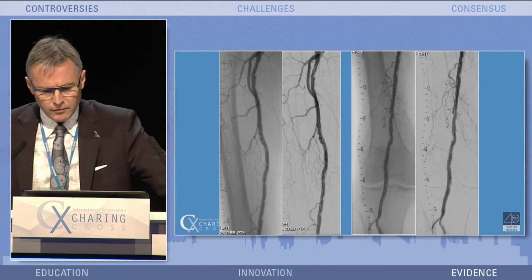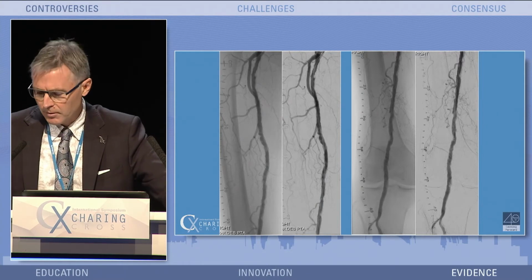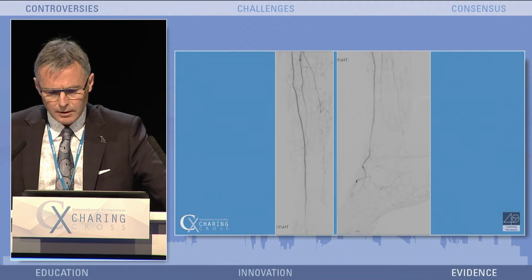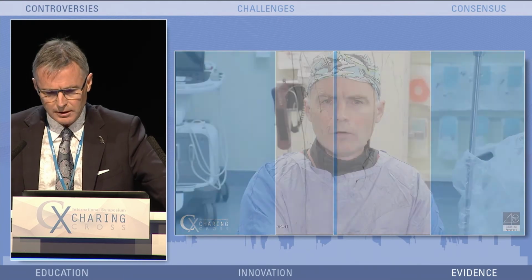So that was again the completion angiography, which really again is a dramatic improvement over a very extensive and heavily calcified segment. As I say, we didn't do reconstruction of the tibial arteries on this particular case.